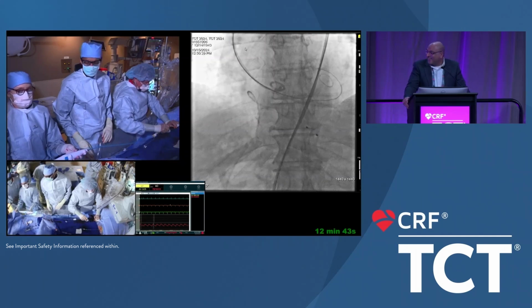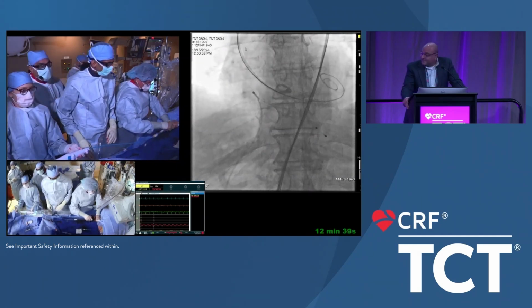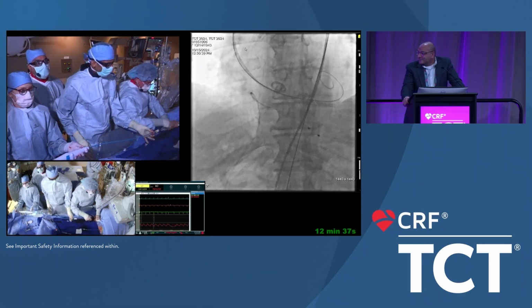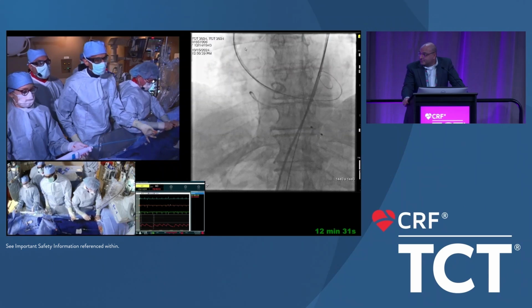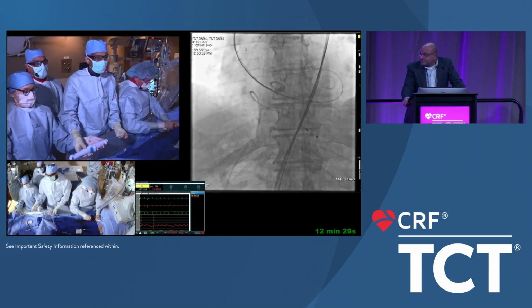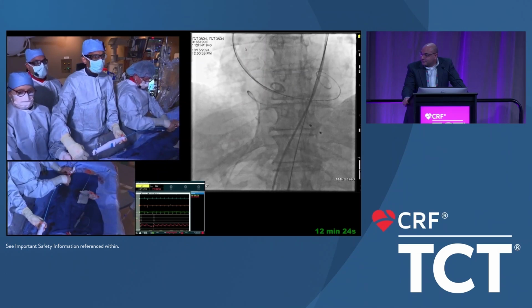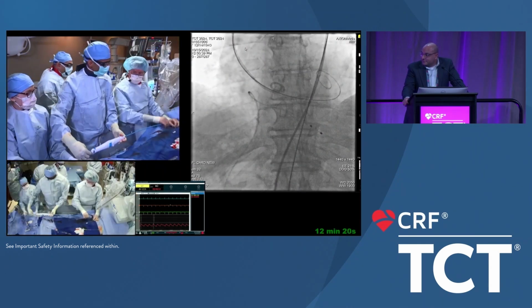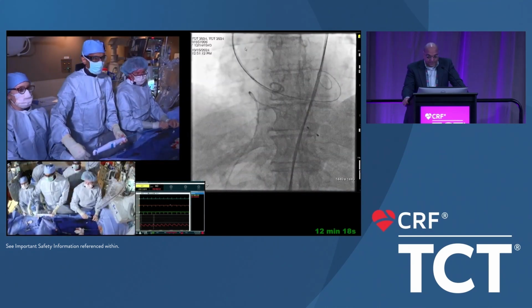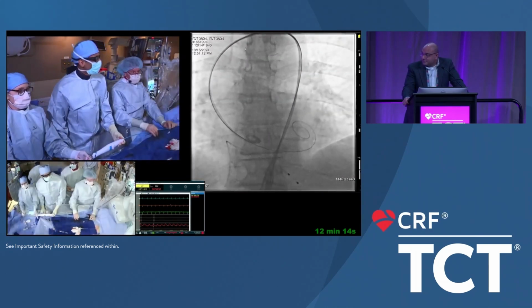So Adnan, can I? Yeah, go ahead. In our experience, in our program, we are very aggressive with the Navitor with pre-dilatation. We think this valve has a great radial force, but just the early initial opening force, it needs some help. So we have changed our practice to do a BAV 100% on all our self-expanding valves, especially the Navitor. And we think that it minimizes any recapturing and redeployment. The valve opens up well, with less bunching on the valve.